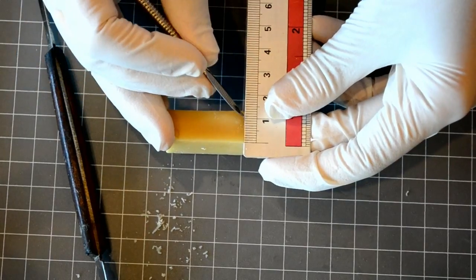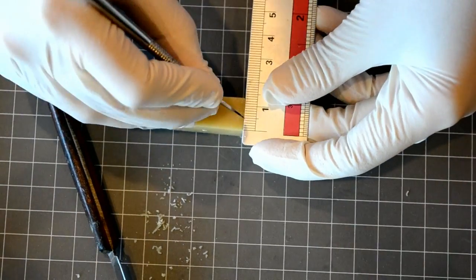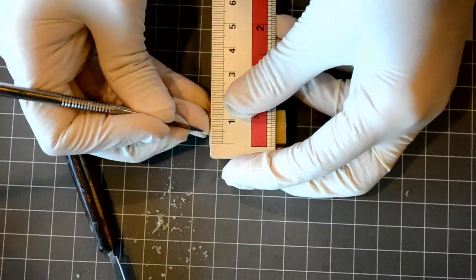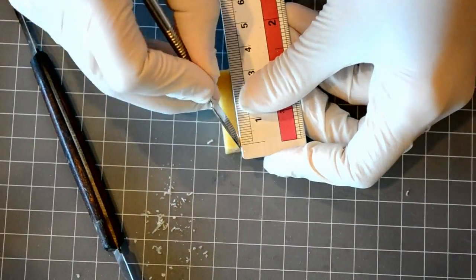Next, carve a vertical line at the center of each aspect using your Le Cron carver. This will help you accurately plot your measurements on the wax block.